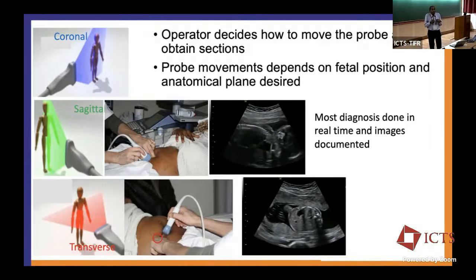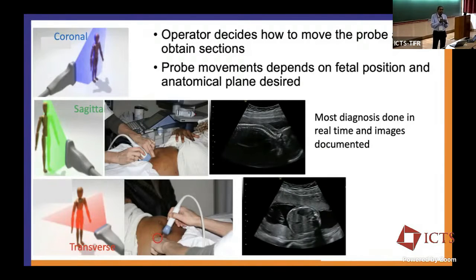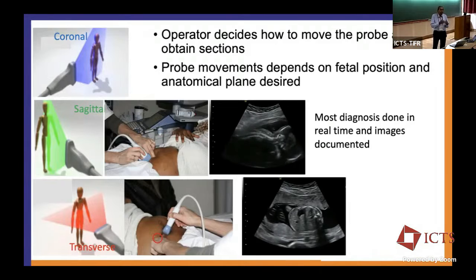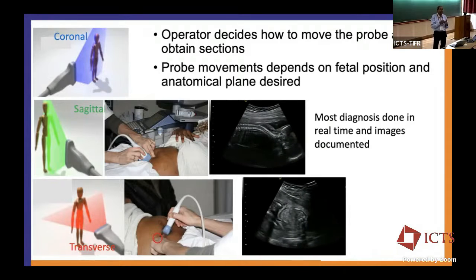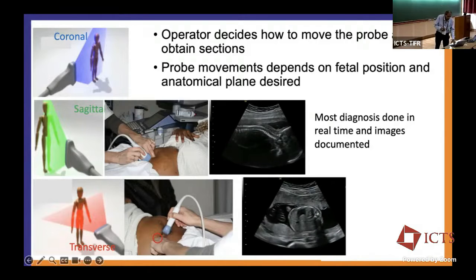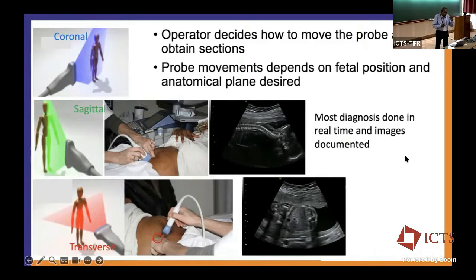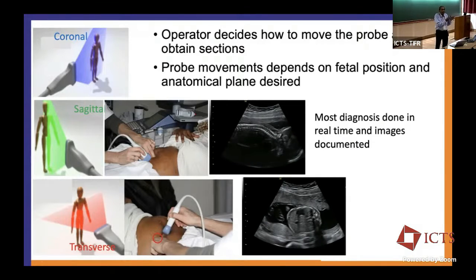But for me, there's a compulsion to produce images, not only image the fetus in a particular fashion, in a very, very standardized way for me to get some meaningful information out of it. So most diagnoses are done in real time and the images are documented.